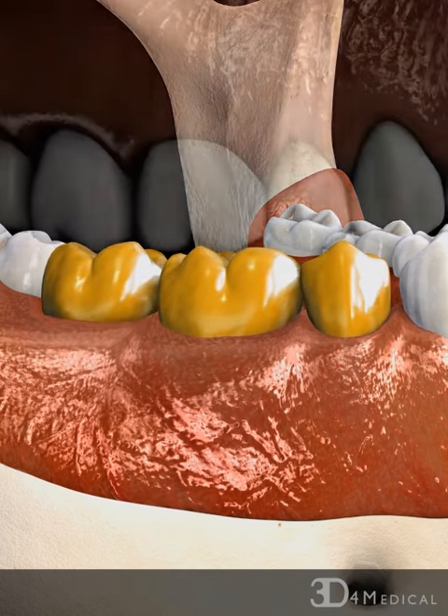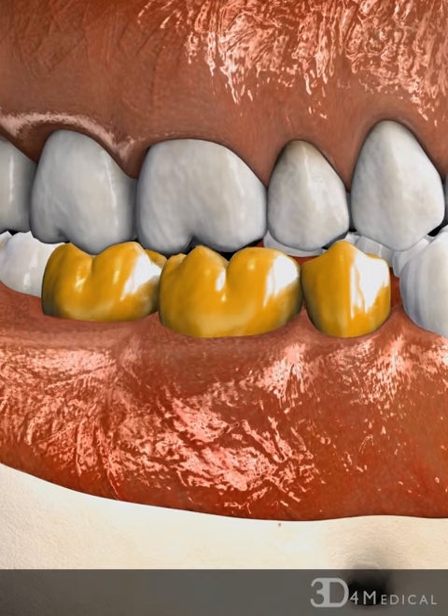Finally, the fabricated gold alloy bridge is fitted and adjusted over the two abutments. Although expensive, gold is used for its ductile and malleable properties, which make it suitable for a dental bridge.